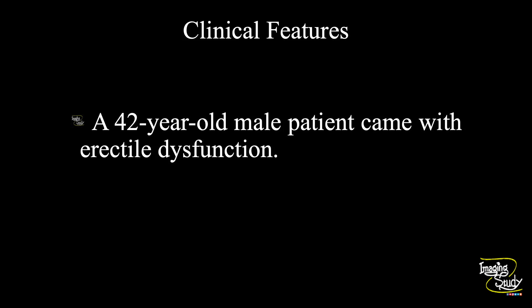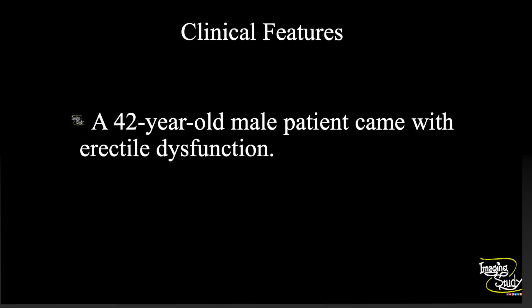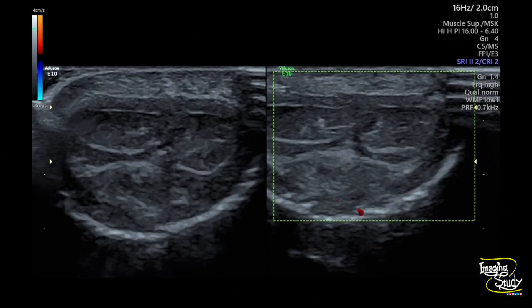I'll go step-by-step so it will be easy for you to diagnose your cases. This is the flaccid state. You can see the transverse section of the shaft of the penis. These two are the corpus cavernosa. This is the corpus spongiosum, and the surrounding covering is the tunica albuginea. You can see tiny echogenic-walled vessels — these are the cavernosal arteries.